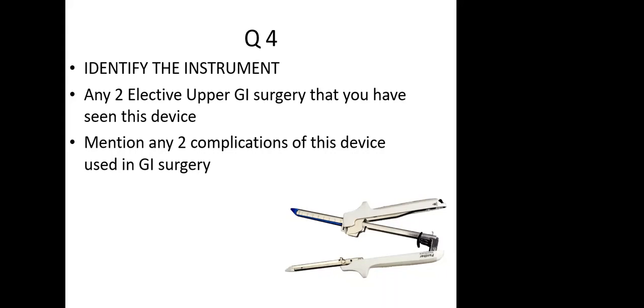So we wait for around... You wait for 30 seconds. Yes, done, sir. Before you fire the stapler, what is the final check that you always do?